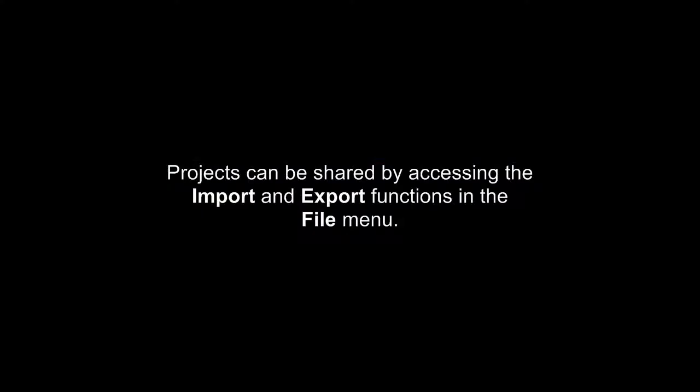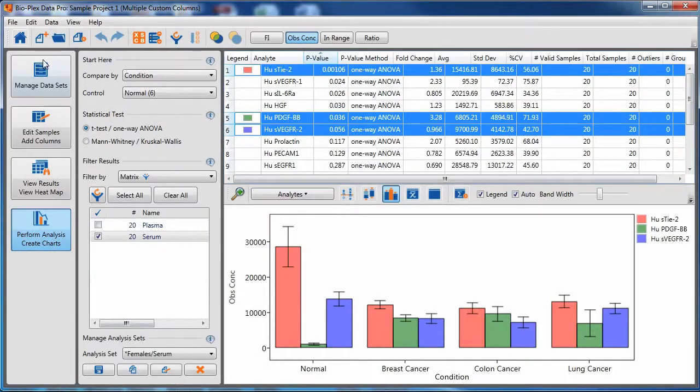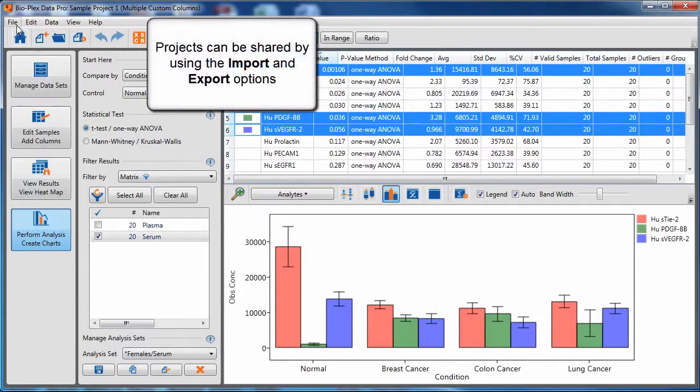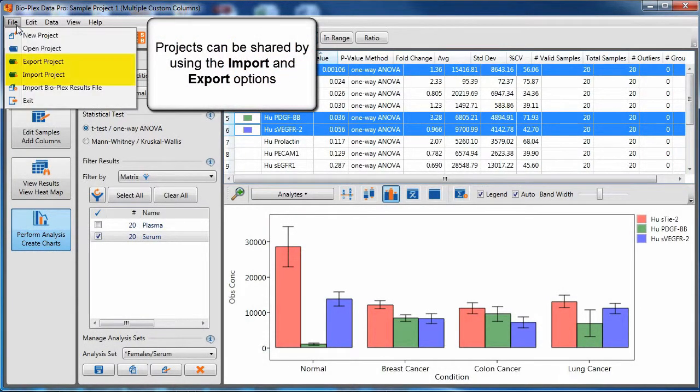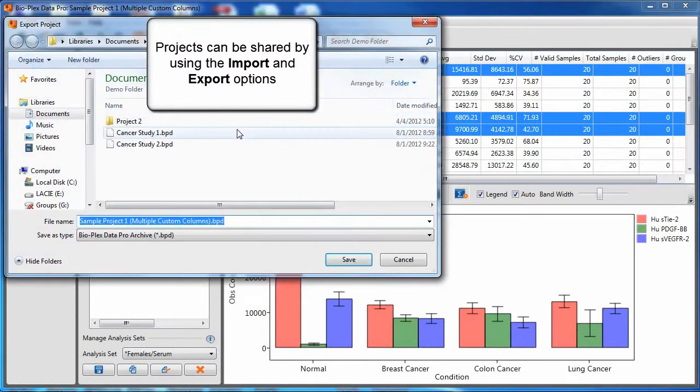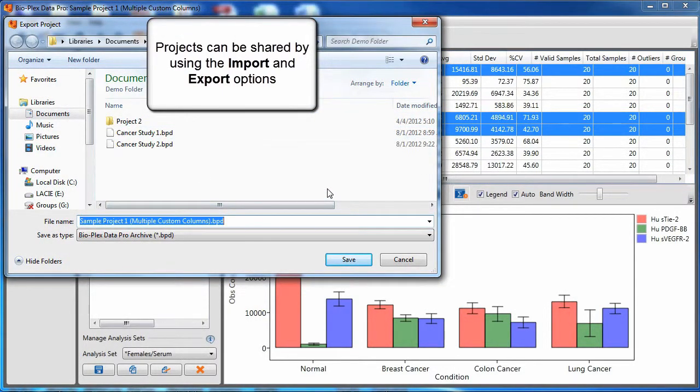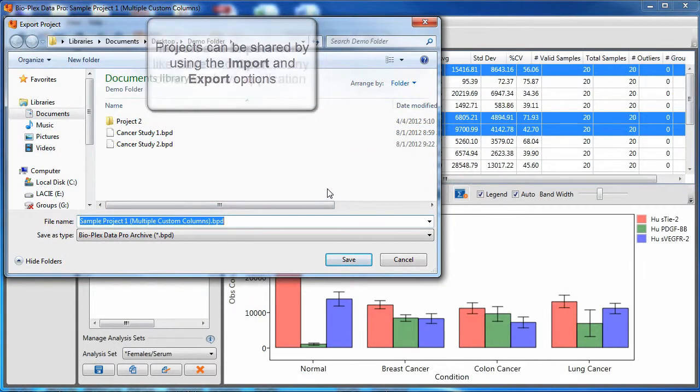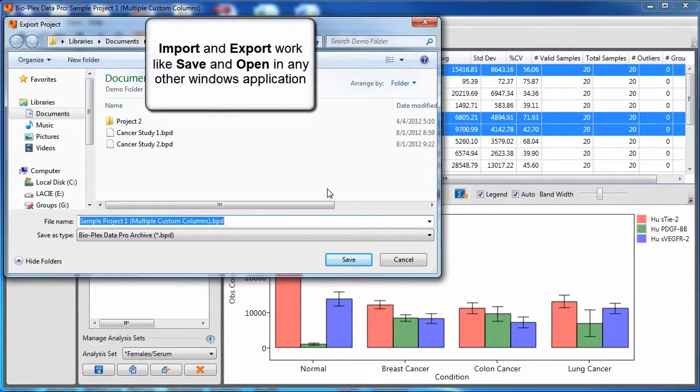Projects can be shared by accessing the import and export functions in the file menu. Access the file menu and choose either export or import project. These dialog boxes work just like any other Windows application.